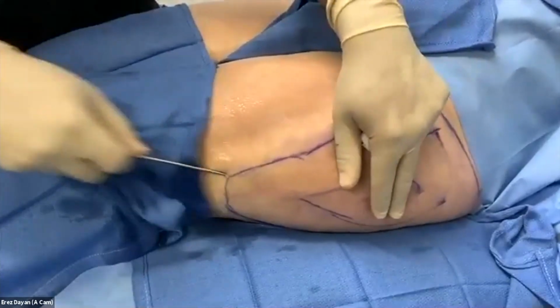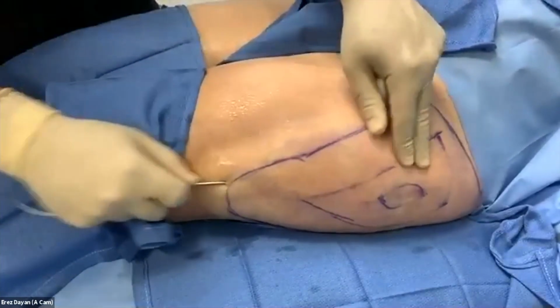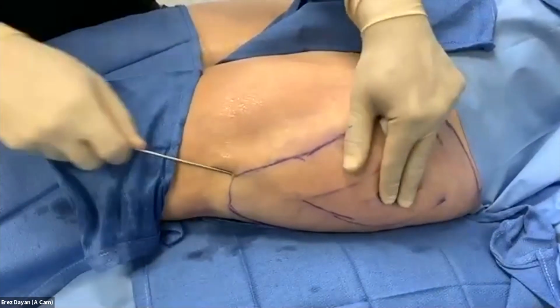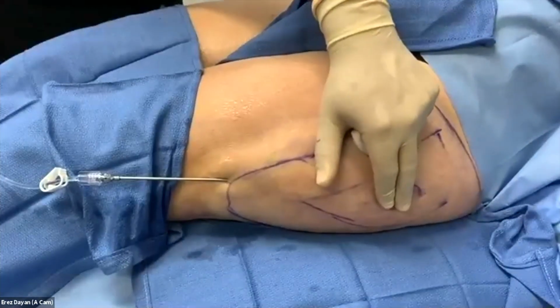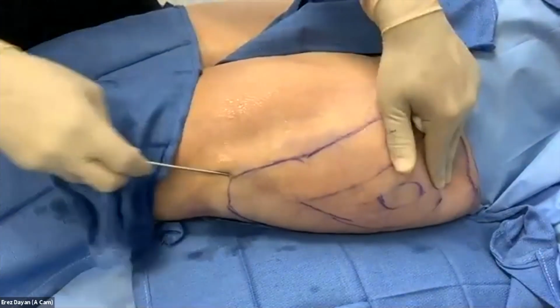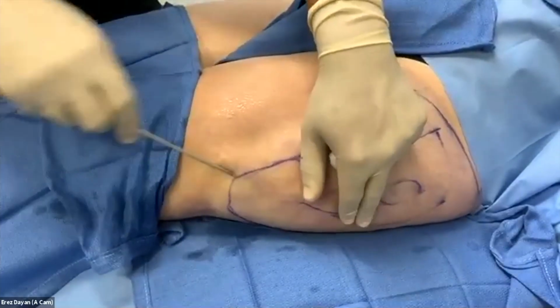Ahead of time, I looked at this and said I'm probably going to lipo about 200 cc's. So I'm going to start with the radio frequency, and then we're going to do just a little bit of lipo. I injected about 400. I usually go a little over. I do more than most people in terms of the tumescent. You could probably get away with doing 200 or 300.